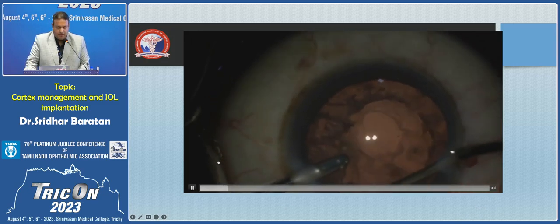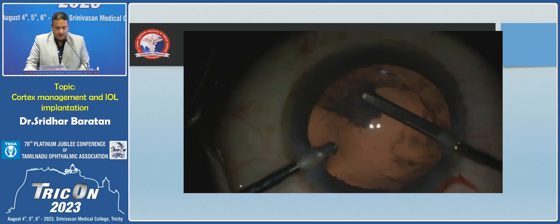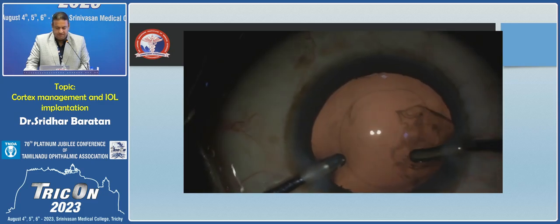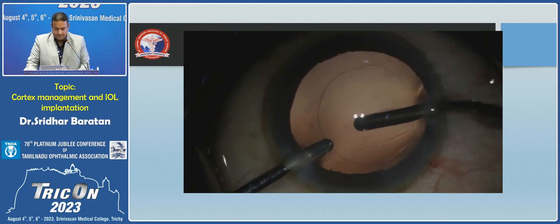So here you see a bimanual irrigation aspiration happening. This is technically the easiest to perform because the chamber is well maintained and you can get the entire thing off. You can see how easily you can get the entire cortex off here.